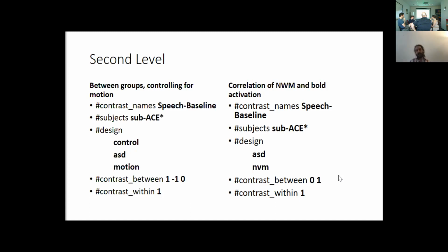Right, and when you want to look at the correlation between activation and novel words per minute, you want to correct for the potential influence of age in that correlation, right? Is that conceptually what you want to do? Yeah. Okay, so then you are perfectly fine. The way you are doing it is perfectly fine, because the control covariate that you are entering, because you are not orthogonalizing or doing anything more fancy, you are effectively removing anything that correlates with age when you are computing what it is that uniquely correlates with the novel words per minute. So that would work as you want.